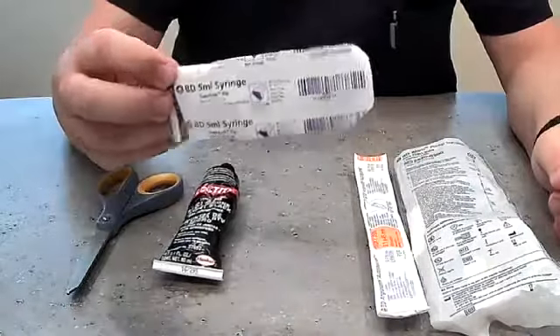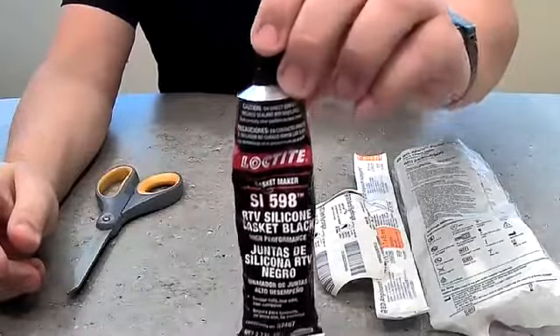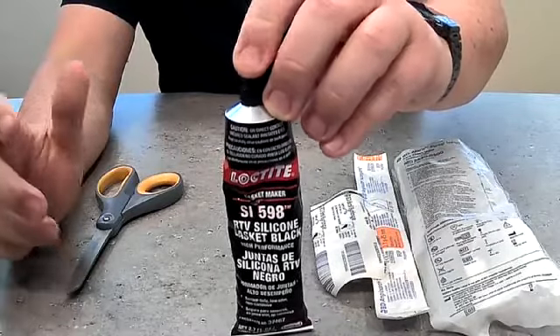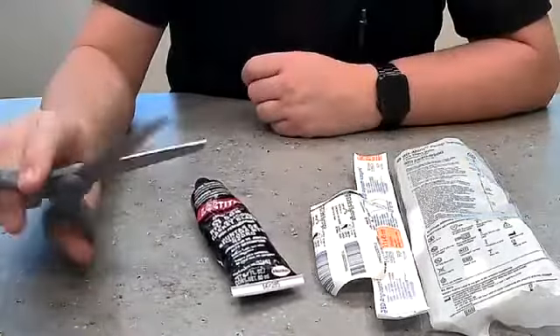We're going to use a 5 ml luer lock. It's basically just a silicone gasket — Loctite silicone. You could probably use pretty much anything that's going to dry up within a couple of hours and be thick enough that it won't let air through the bottom. And then just some common scissors.